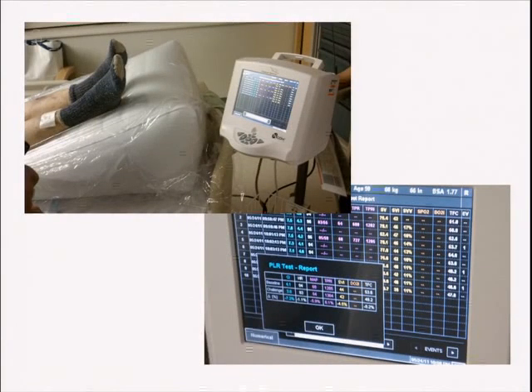So we currently do this in the emergency room. We do this in the ICU. Our nurses do it, becomes part of the standard of care. So when I'm on call, they call me and say, oh, patient's fluid responsive, patient's not fluid responsive. It's really easy to do.